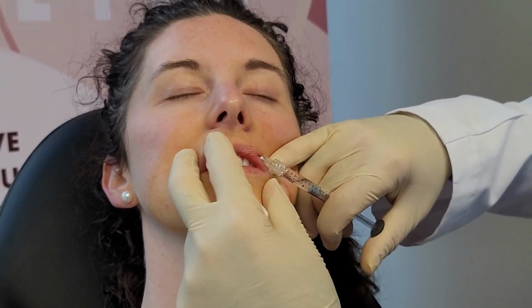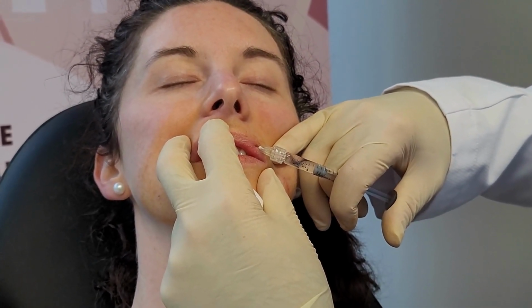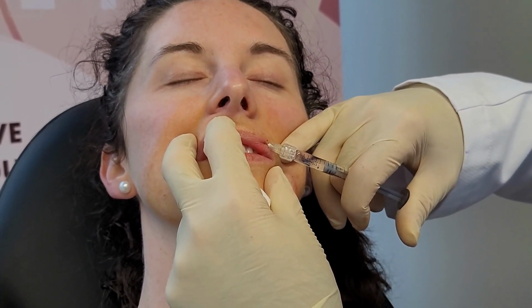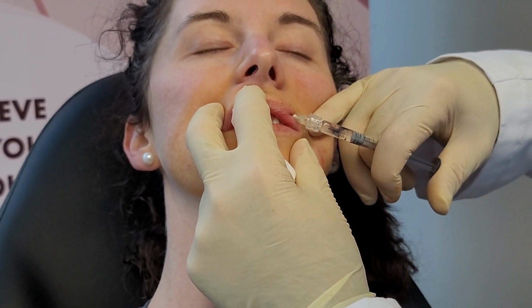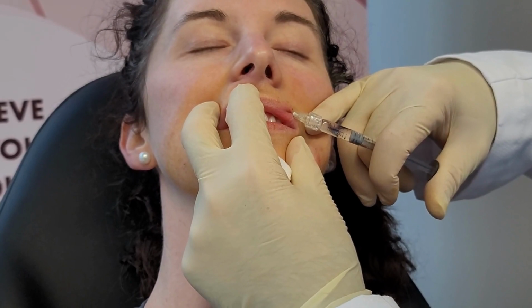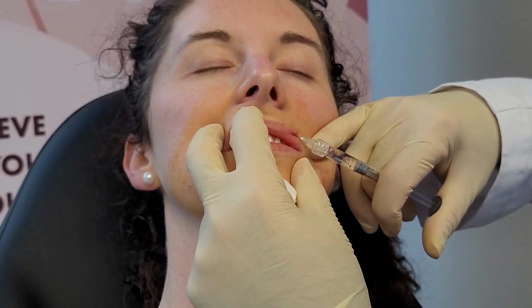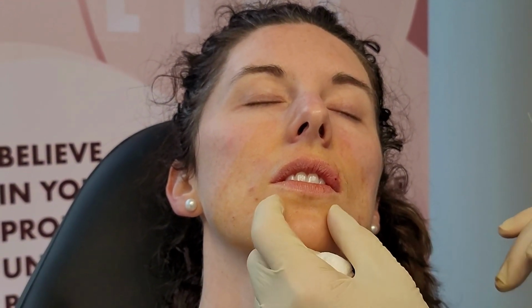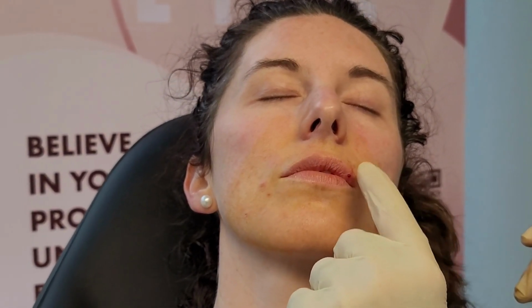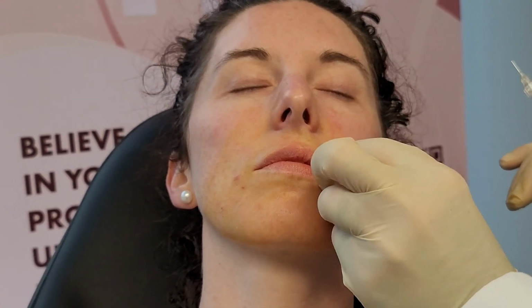Whenever I want to evert the upper lip, basically we're going to try to fill some of the wet mucosa so that it sits a little heavier on the teeth and kind of pops. Right now the wet mucosa kind of hides inside the mouth, and we're encouraging it to come out with that filler. And close your lips. And you can already see the difference. We're getting there. We're working medially.